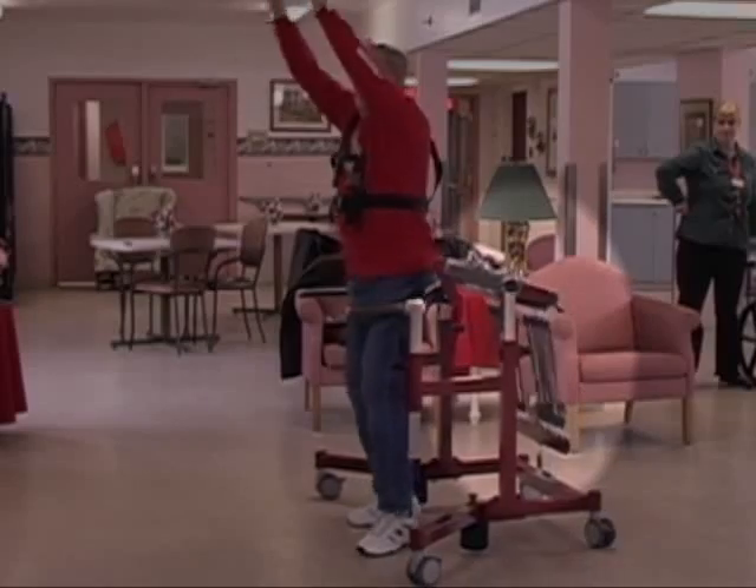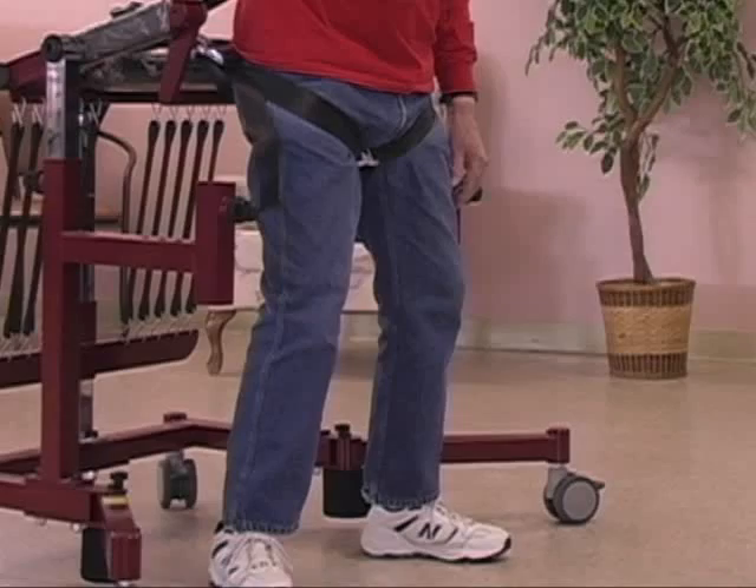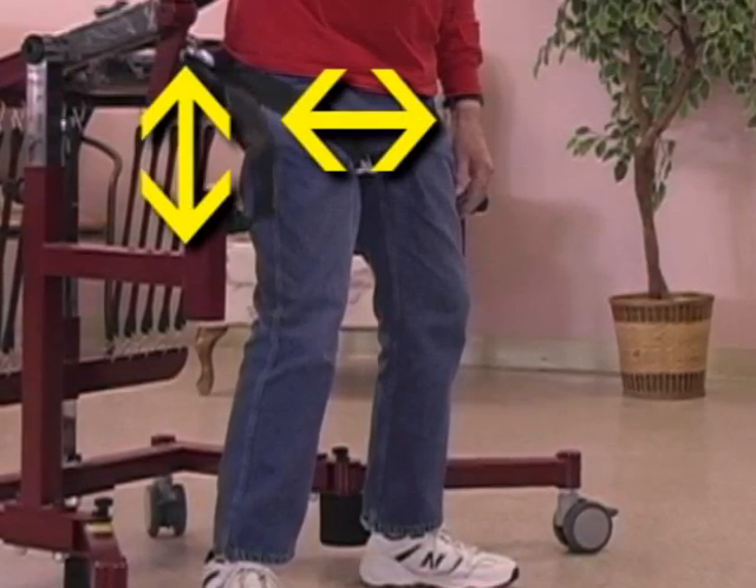The bungee cords provide safe and graduated support, and the seat follows the body around two different axes, so it does not interfere with natural movement.